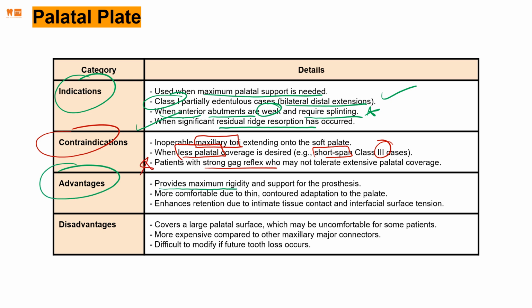Advantages: provides maximum rigidity, support, comfort due to its thinness, contour of the palate, enhances retention due to intimate contact. Everything is great. But then there's always disadvantages, right?